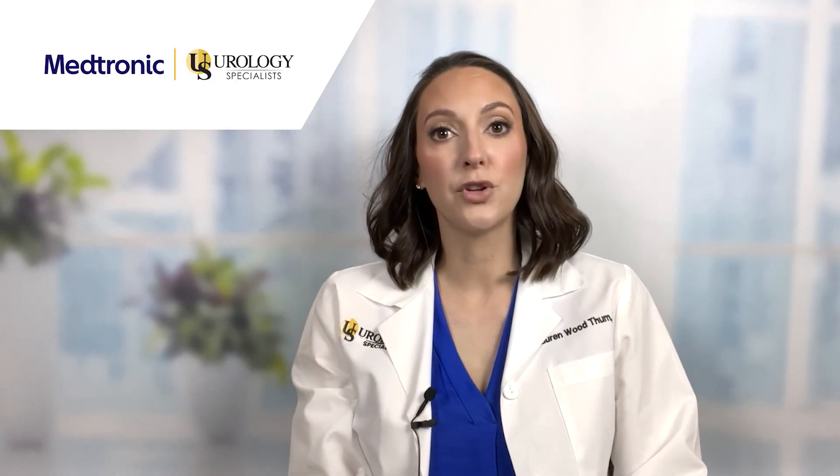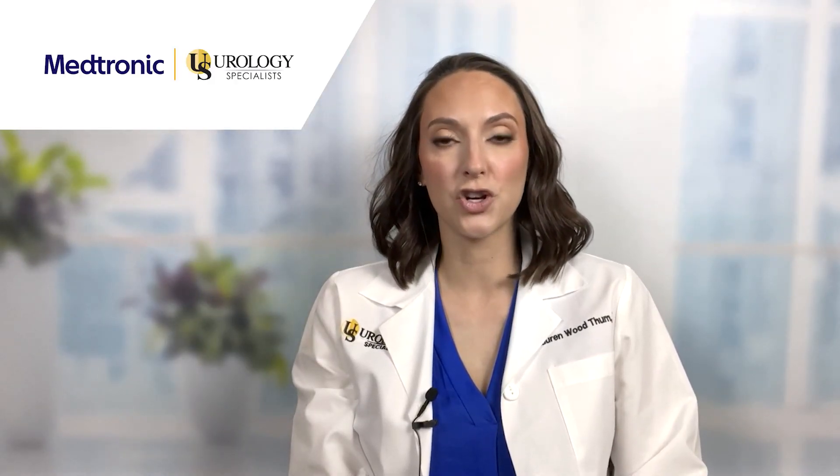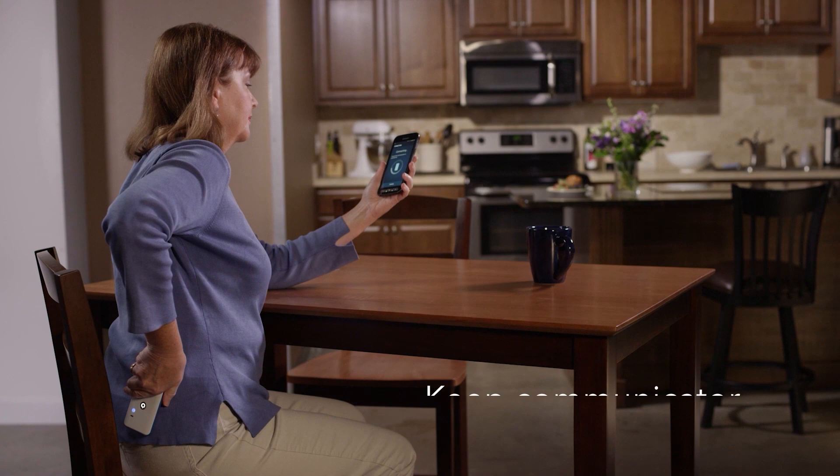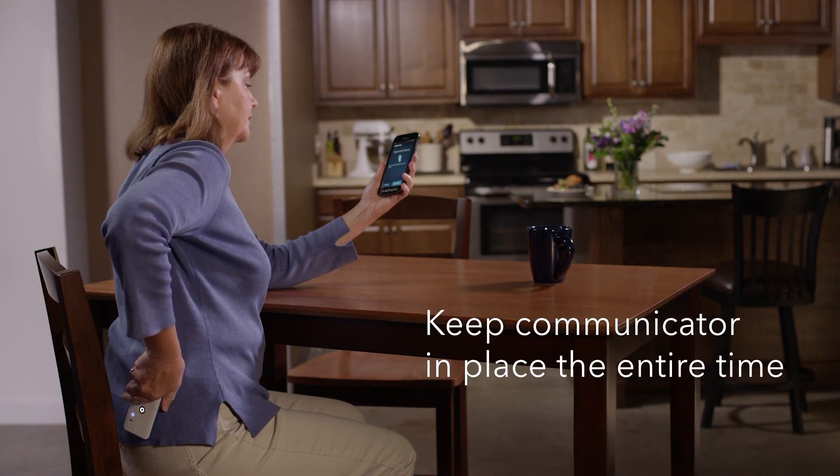First, please ensure that both your programmer and communicator are charged. Turn your communicator on by pressing the center button and place it with the blue side against your skin directly over your implant. This communicator needs to remain against your skin until you have placed your device in MRI mode.